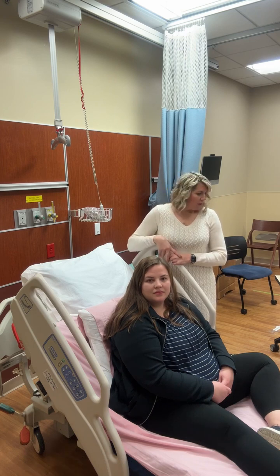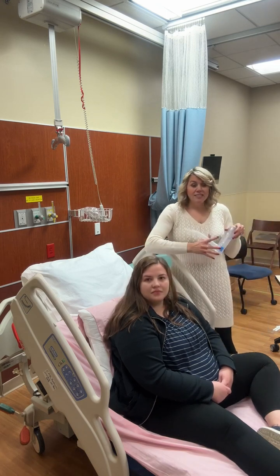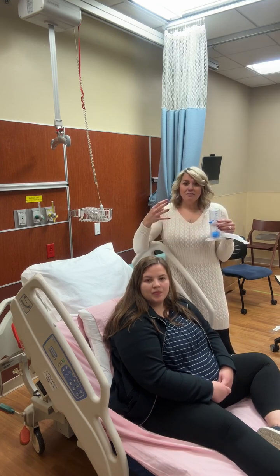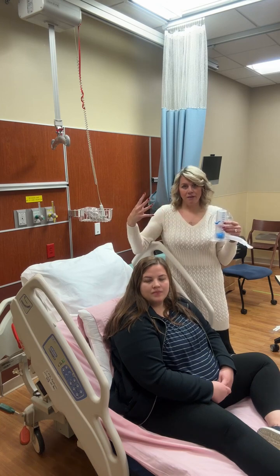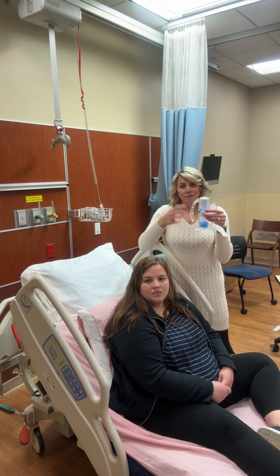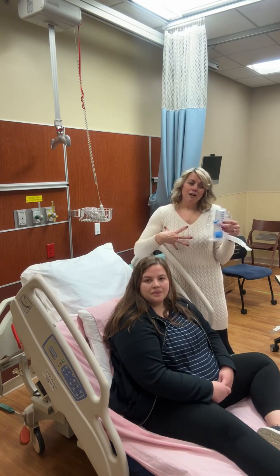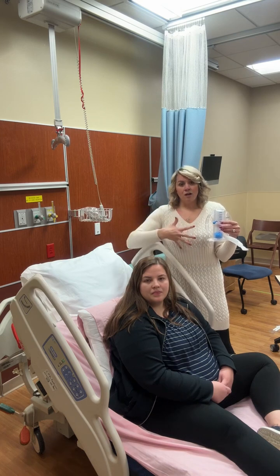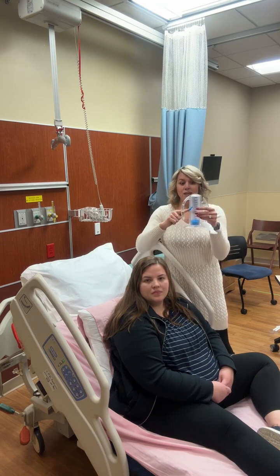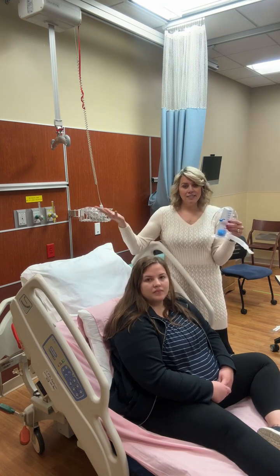And so the first thing we're going to talk about is an incentive spirometer. The spirometer part is the fact that when you breathe in, it's spirometry, it's measuring something. And the incentive part is that you get a score every time you take a deep breath in. So that's why they call it incentive spirometry, because we're measuring the capacity of our breathing, our inhalation, and the incentive is that we're going to feel better, we're going to be able to breathe better, and we get a fancy number when we do it. We see a cause and effect, immediate gratification. So that's why it's called incentive spirometer.